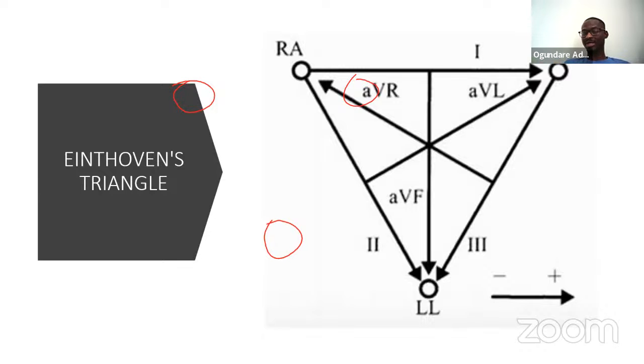Okay. You agree with me that if your patient is just maybe in ITU for continuous monitoring, you are not going to be placing 10 electrodes on the patient. Okay. For continuous monitoring, we use just 3 cables, and this is the idea. Because to be honest, it's just the 3 of them that are capable of generating these 6 leads. So if you need more, then you can proceed and do a complete 12 lead ECG. The same is applicable with 5 cable ECG.